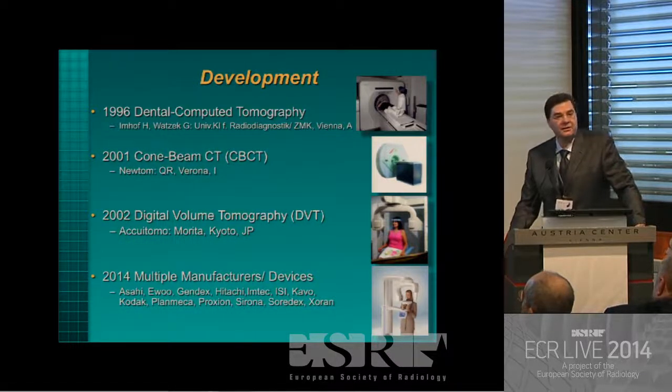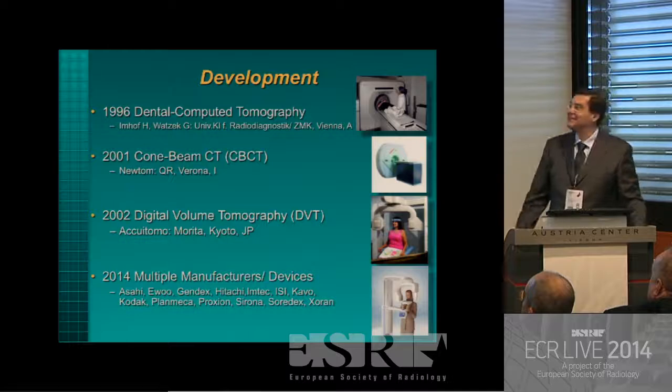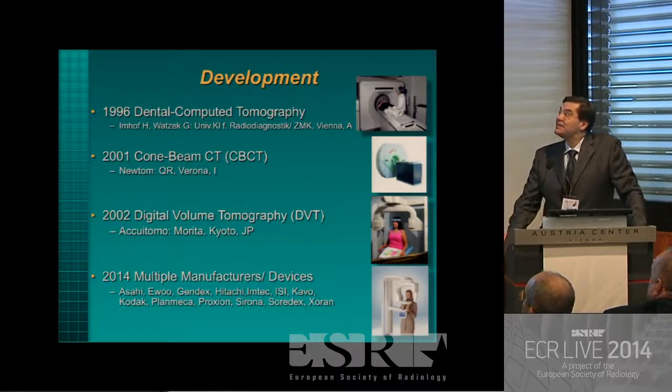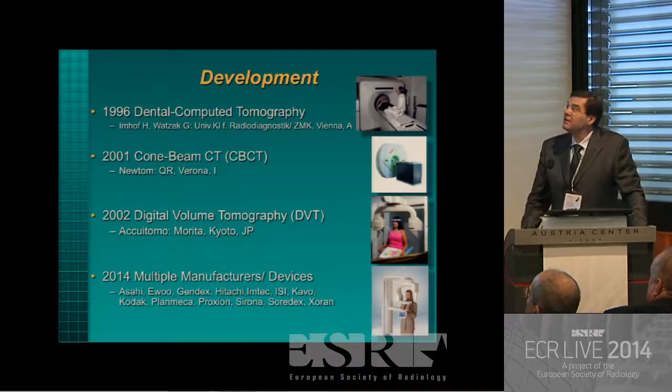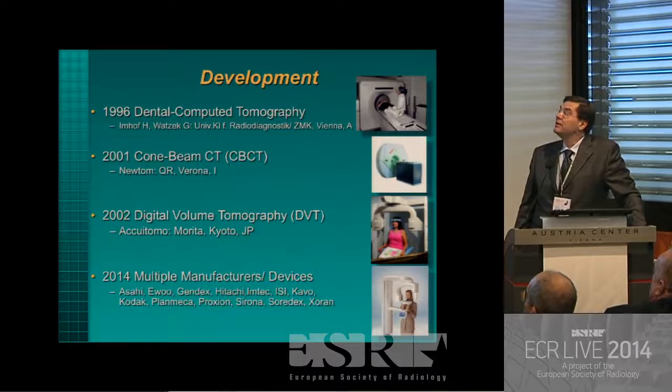and I'm honored that Professor Robinson is here today, who was the first to operate this device at that time. Since then, this device is still operating at the dental clinic and the dental school in Vienna. In 2001, the first cone beam device from an Italian company was sent to the market. It was very large and difficult to handle.